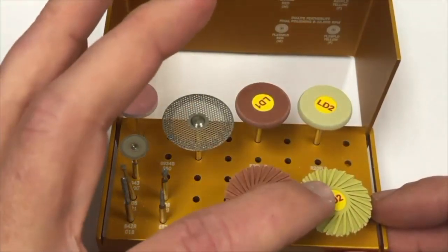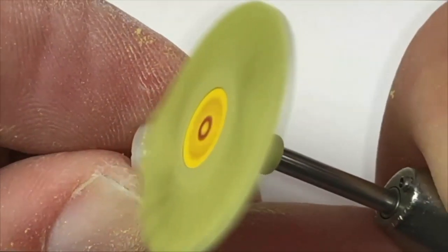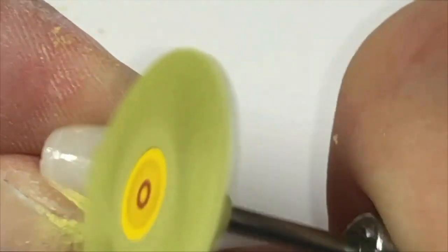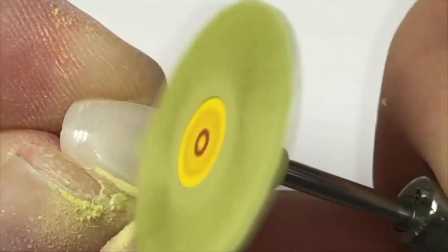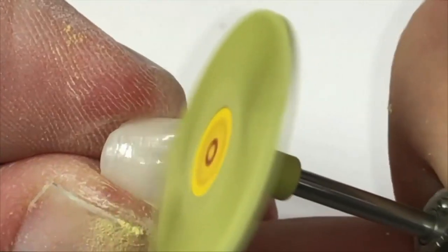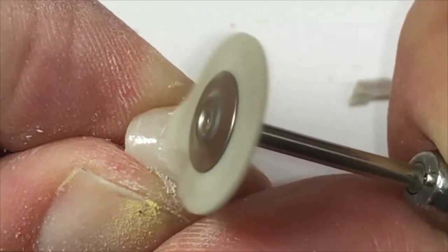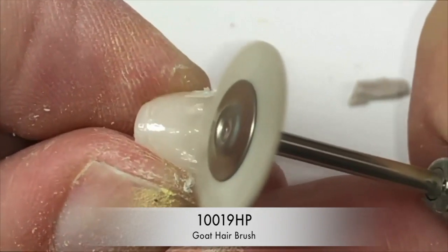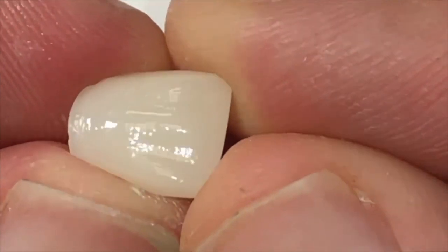After polishing with the LD2 Fine Dialite Wheel, the facial surface of the anterior restoration is polished with the Fine Dialite Featherlite Polisher. This is best for the facial surface polish because it can be adapted optimally to the tooth surface. The LD2 Fine Dialite Featherlite Polisher is used at 3,000 to 6,000 RPMs and is used in an up-and-down fashion to only polish the reflective surfaces. The final polishing is completed with Brassler Dialite paste and a goat hair brush. The final polish is now complete and a natural aesthetic polish and luster is achieved.